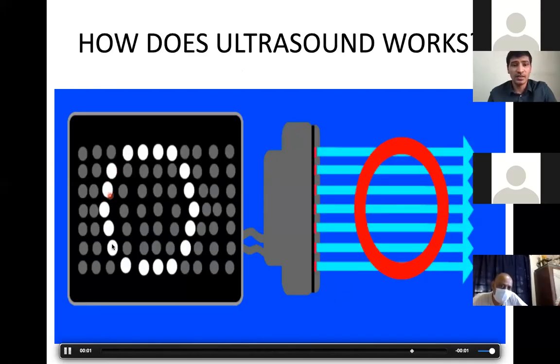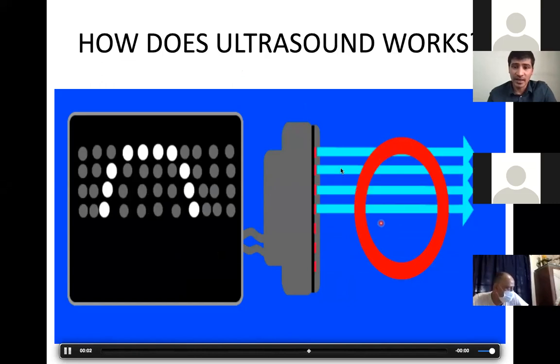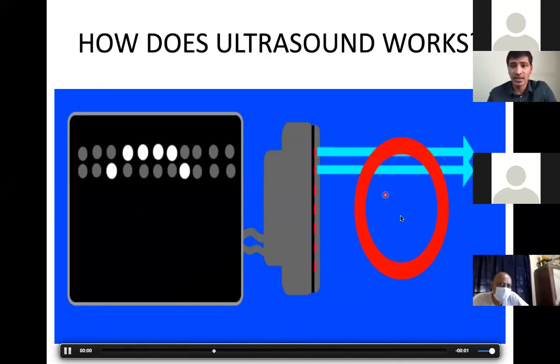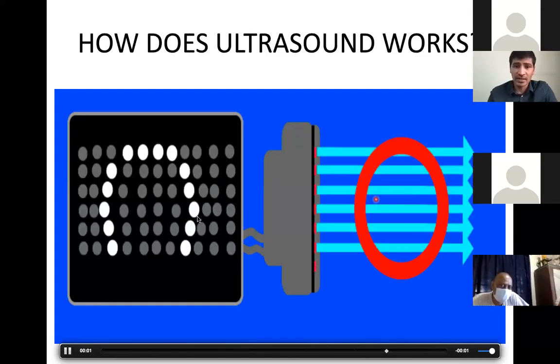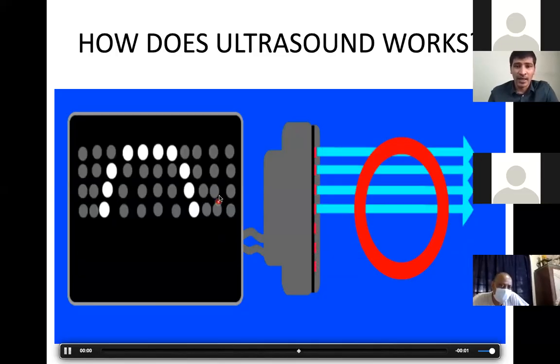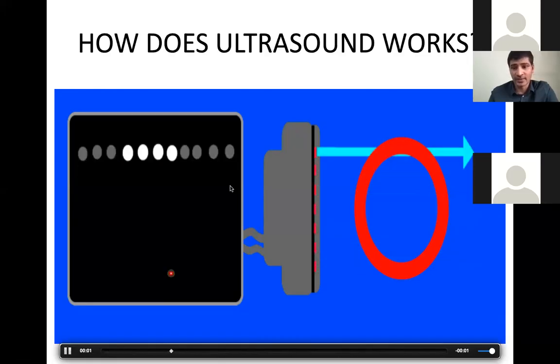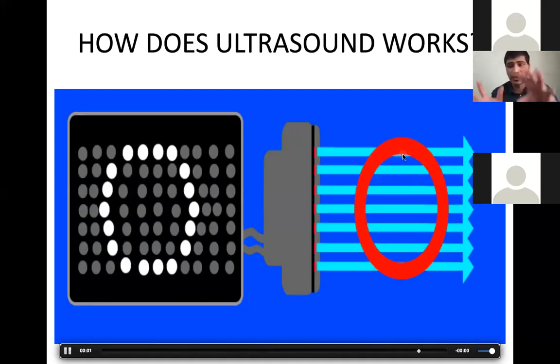So we need to understand that this is the real image, and this is the medium that the image is staying in, right? In between there is also a medium. So this area is looking black or gray. You can say gray, that's fine. And this looks really white. So basically it's not the whole image you see.